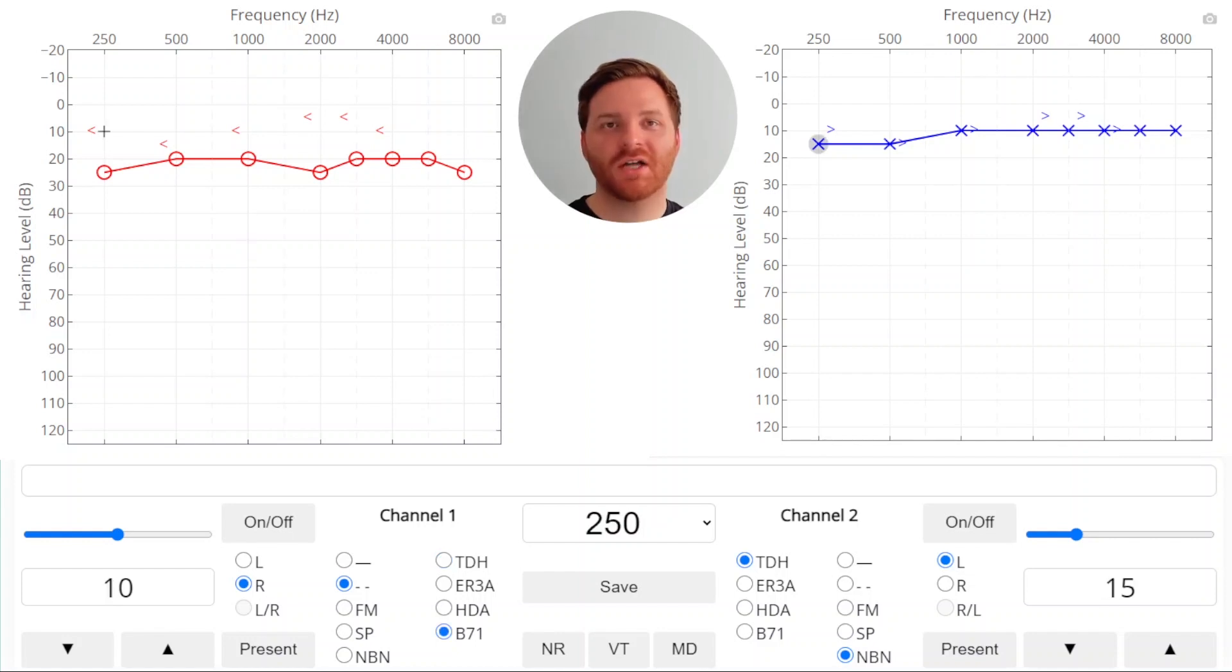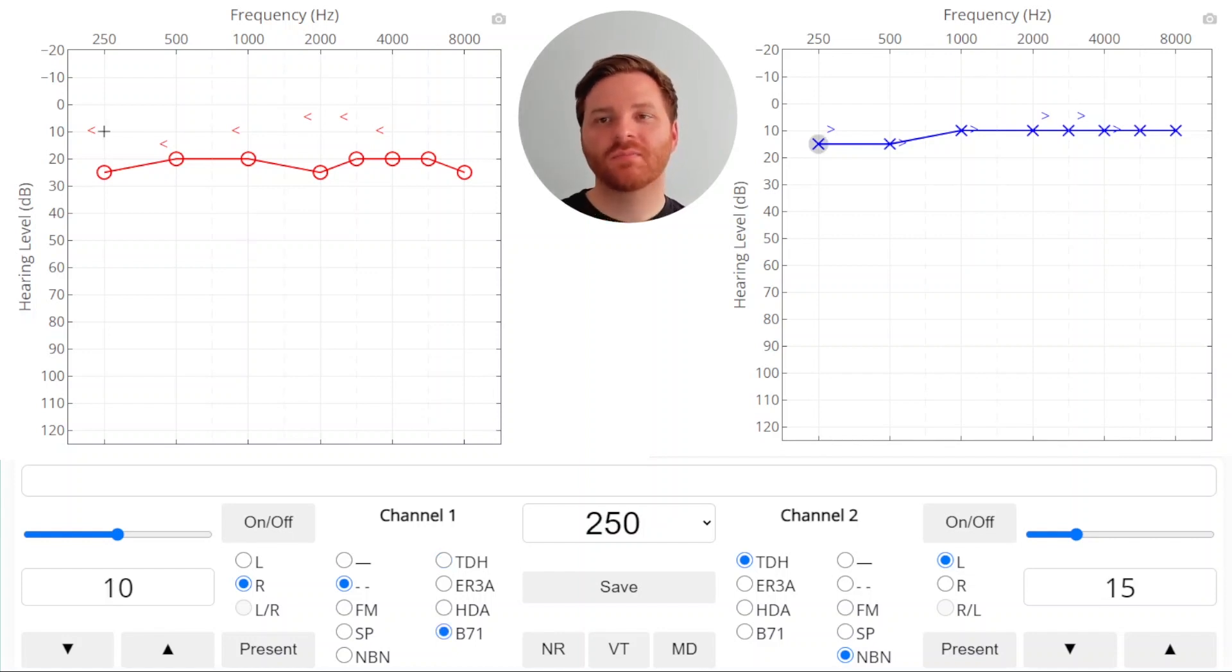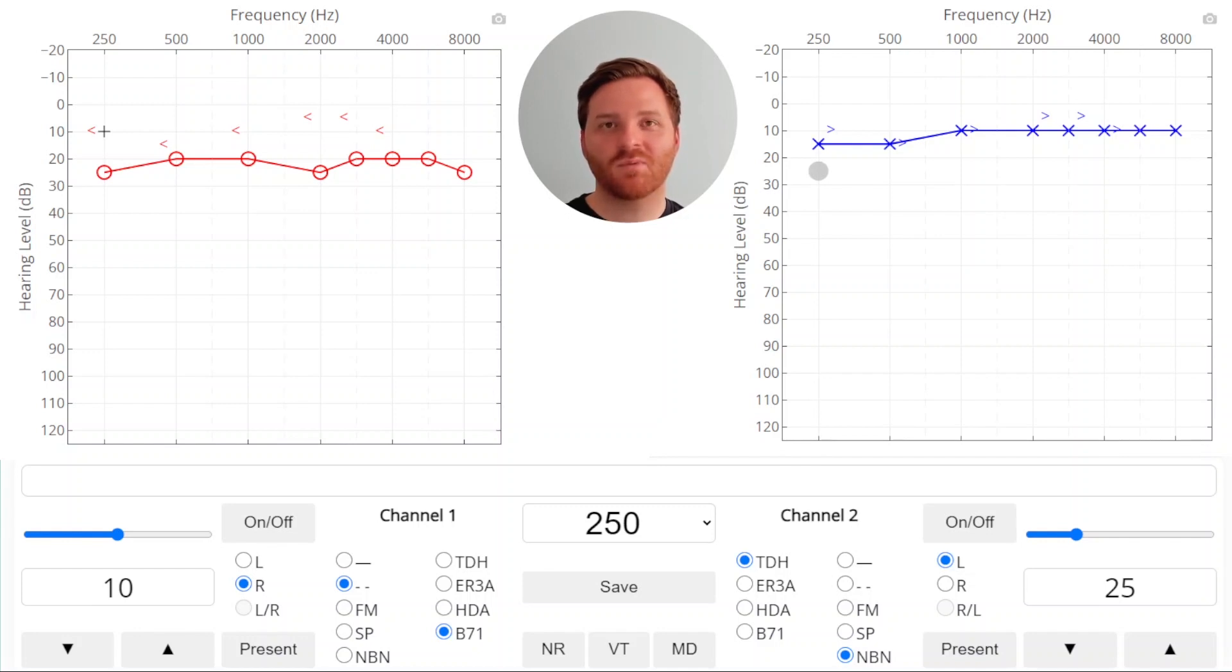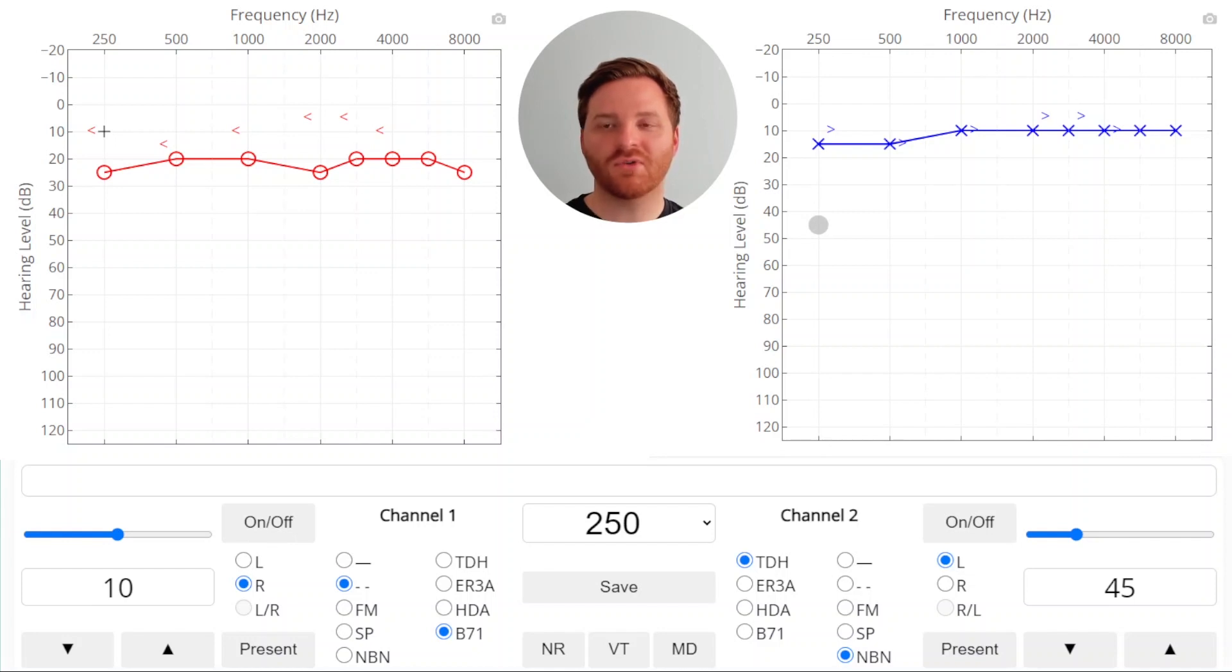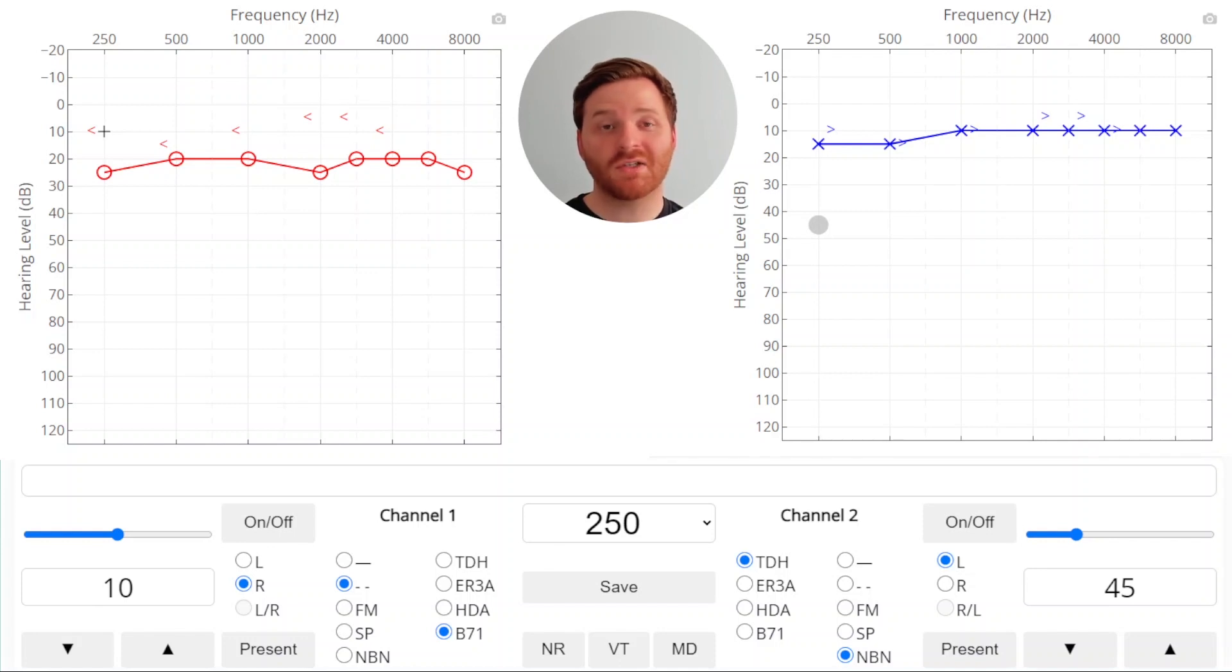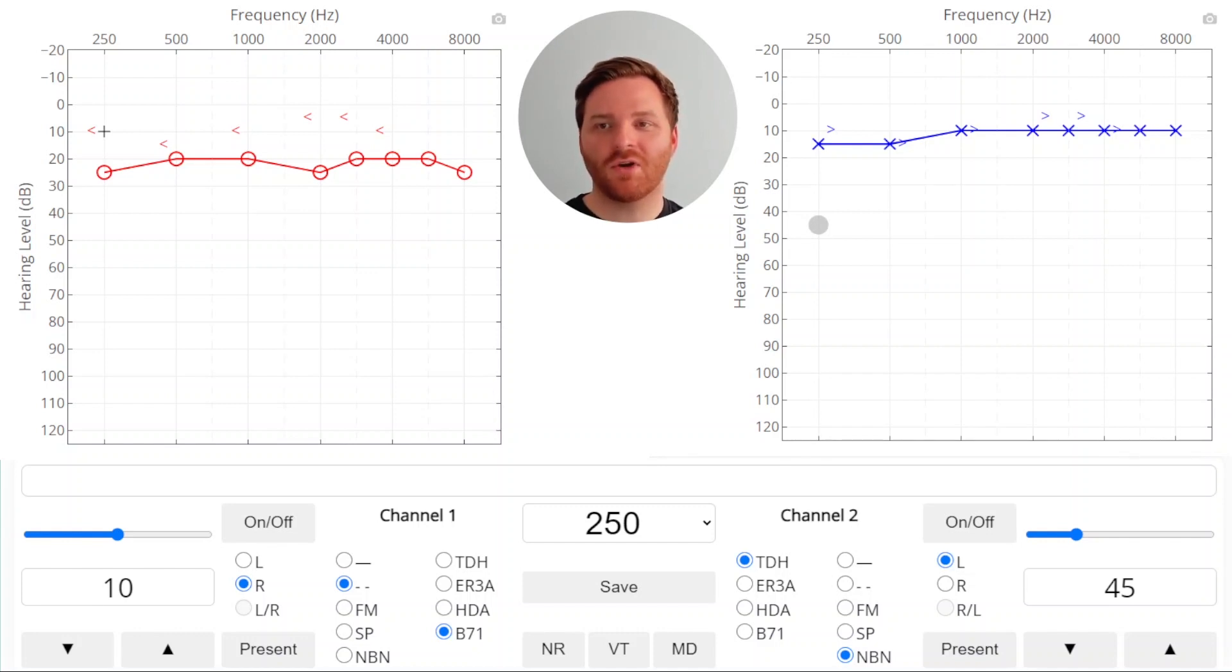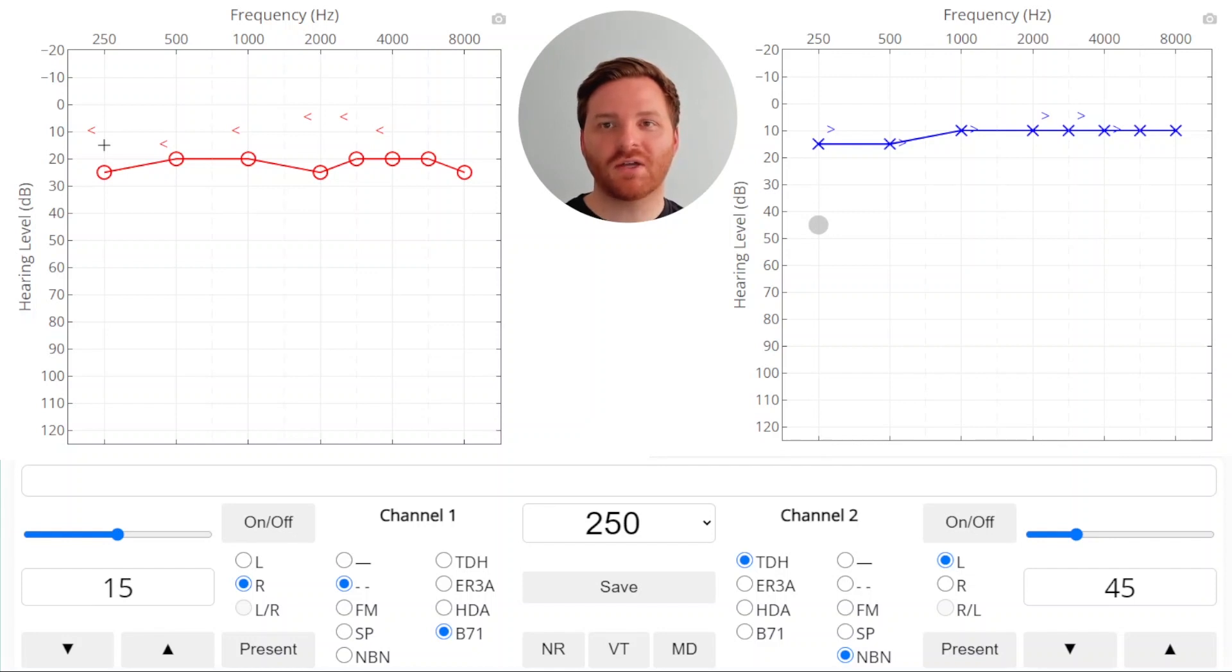Let's mask bone conduction at 250 Hz. We'll turn on our masker at the air conduction threshold of the non-test ear plus a 10 dB safety pad plus the occlusion effect. In this case, we're going to use 20 dB as our theta default bone conduction occlusion effect. We'll present our stimulus and see if we get a response. There's no response, which means that response that we used to get was coming from the left ear. But now we've got enough masking in that ear to cover it up. So we're going to raise our stimulus until we find the true threshold.